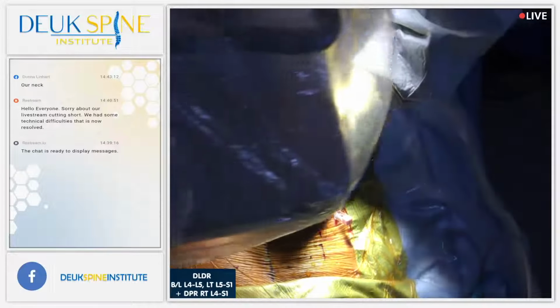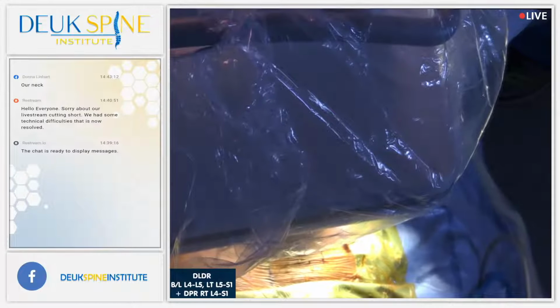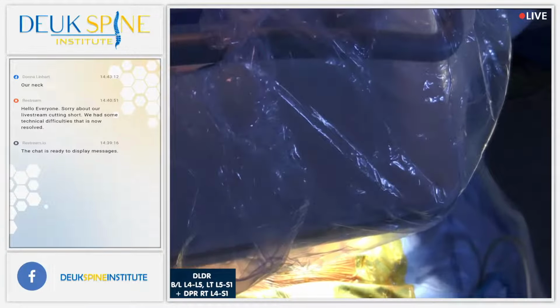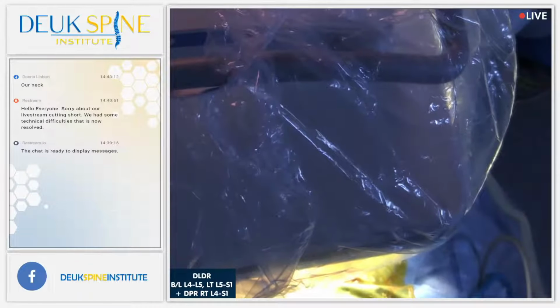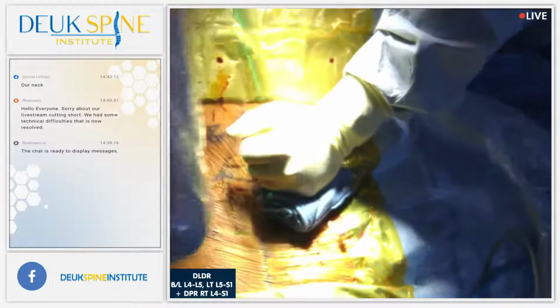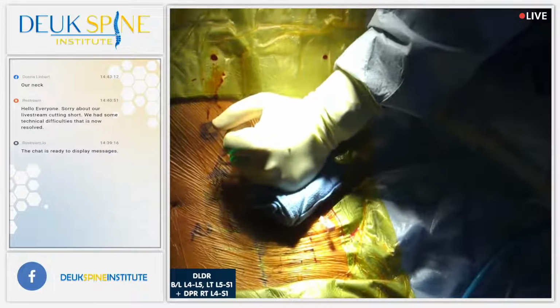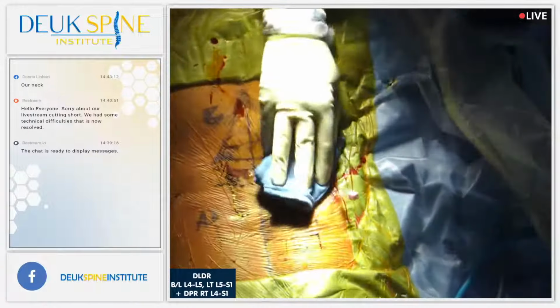Any questions? No current questions. All right, so I'm just checking with my team. We're going to do these next bilateral 4-5, and we're going to do the DPR 4-5-5-1 right side. Yes. Then we're going to bring Patel in to do the DPR on the SI. Yes, good. All right.